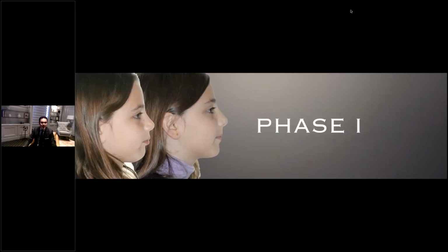So the mandible here, we can see that the patient has a beautiful mandible now, a beautiful, completely different relation of the structure, right? So this treatment can be beautifully enhanced by a functional approach with the Carriere motion appliance in class 2 malocclusion.